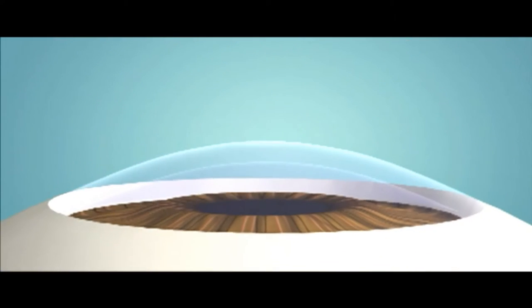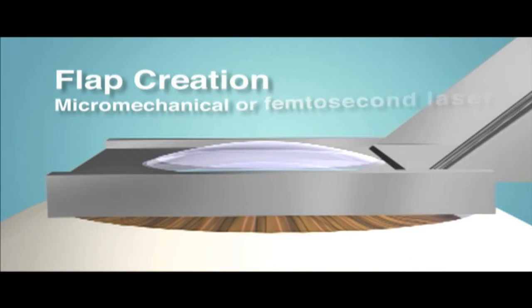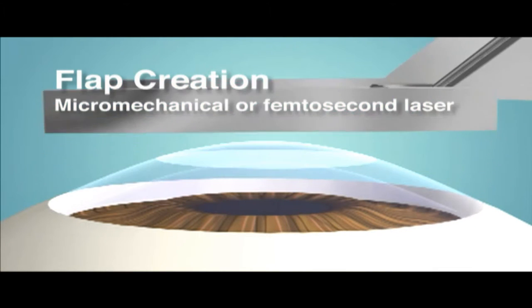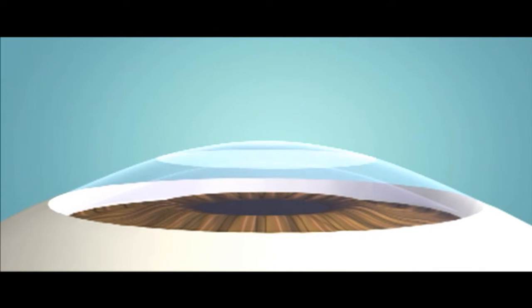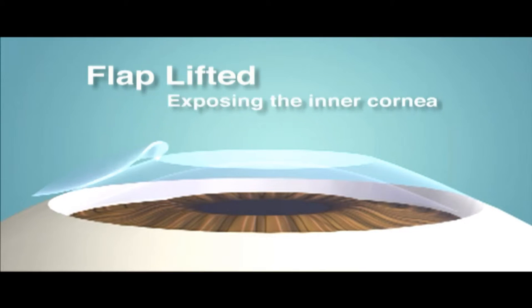With LASIK, a small flap is created in the front portion of the cornea with either a micro-mechanical device or a special laser system called femtosecond laser. The flap is then lifted and an excimer laser controlled by a computer is applied on the remaining cornea to sculpt a new shape.